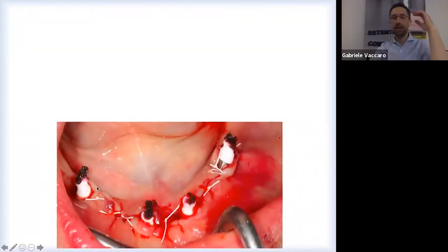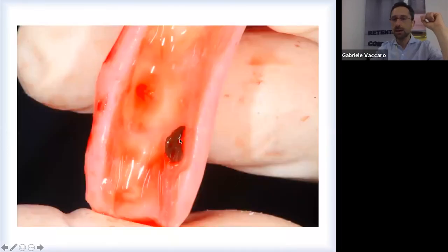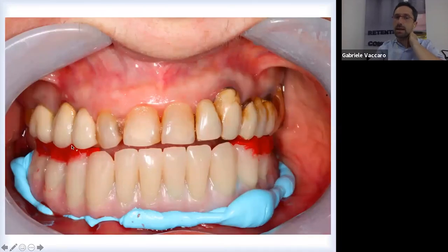Then, how to check that our impression tray doesn't interfere with the plastic transfer? Simply stain the transfer with toothpaste or lipstick, something that is thick enough to stay in its place, and then check that there is no trace of that paste in the impression tray. Otherwise, if you see some trace of that, dig it with a burr until there is a perfect passive fit of the impression tray.